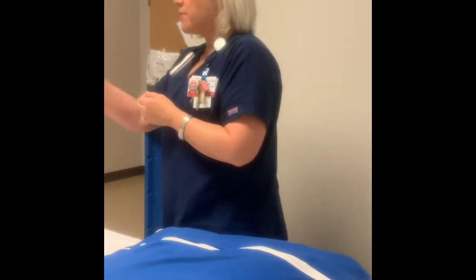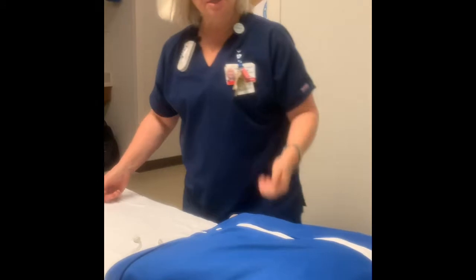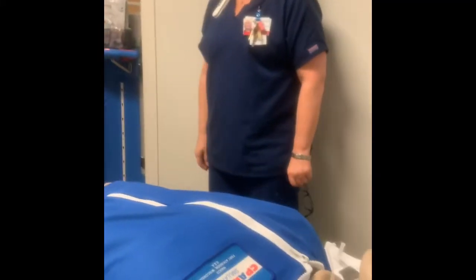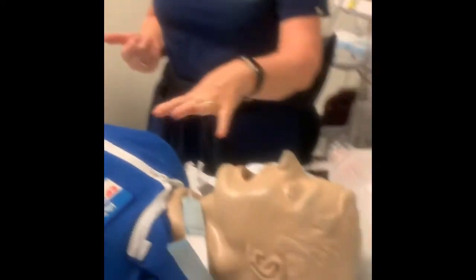Okay, so I have a patient that has a laryngectomy. I need you to come up. This trach has fallen out. I have a laryngectomy and my trach's out. What are you going to do? You're the nurse. Assess their respiratory status, ask them. Well, they can't probably talk, but we're going to ventilate down here with a pediatric mask.